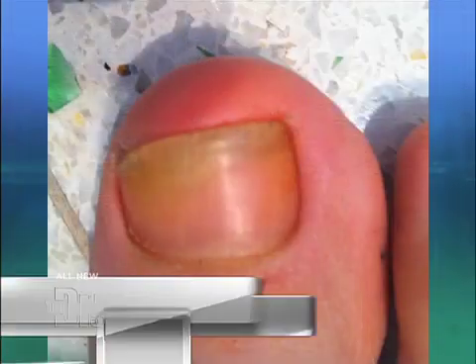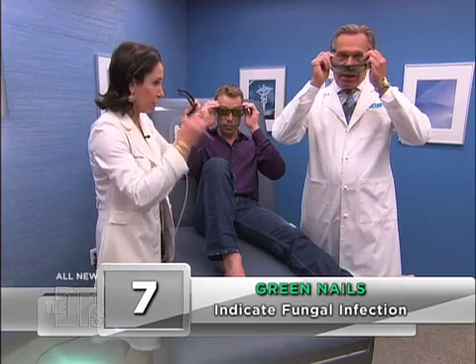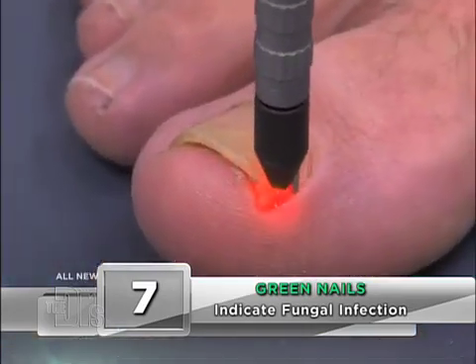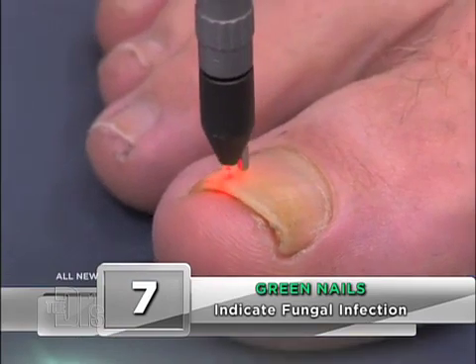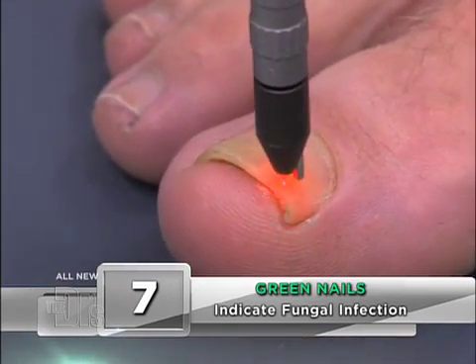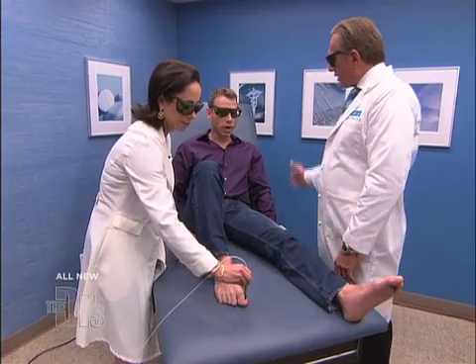The problem is because the fungus is in the nail plate and in the nail bed, it's so hard to treat with creams. So using this laser — put your glasses on, everybody green glasses — we just pulse it right across the toenail, back and forth. And what's nice, because it's the fungus that we're targeting, there's no pain, right Garrett? So you're not feeling anything.